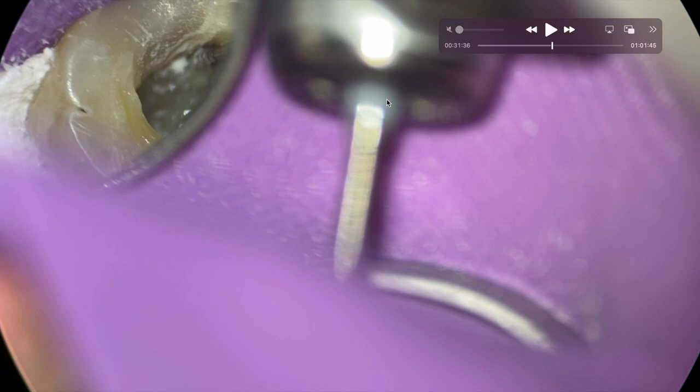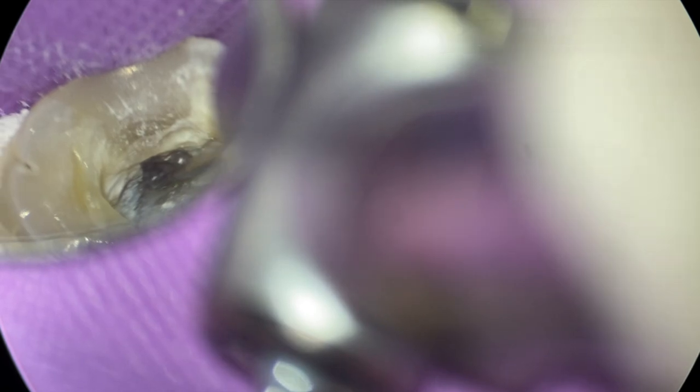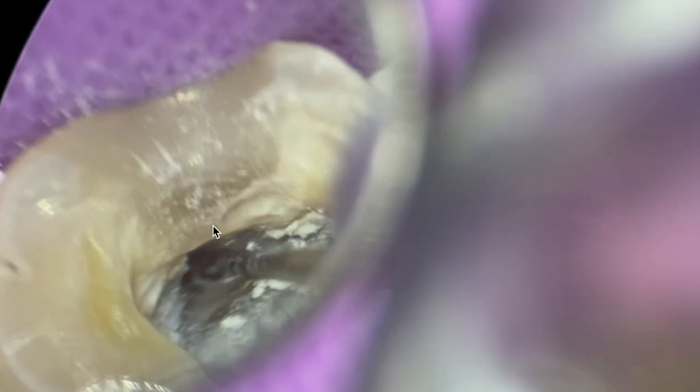This is the gray band, so it's a lot smaller. Yes, there was a risk of perfing, actually. See that little white dot? I'm kind of like, well, I thought it was from my Explorer. So what I'm going to do is I'm going to take the side of the round burr, and I'm actually going to put lateral pressure on there. Cat out of the bag, this is MB2 right there. It's in the totally wrong position that I'm used to. I wonder when my file would not go down it. I'm thinking like, I'm going to laterally move the burr to that and open it up so I can get top down access into it, rather than trying to go in from the side with a file, which is not working. The pressure I'm putting on here is lateral, not apical.